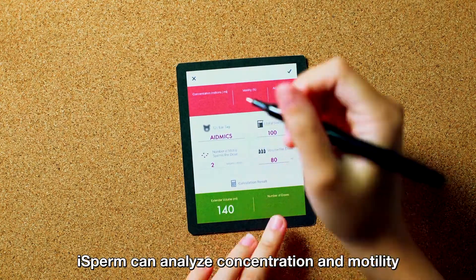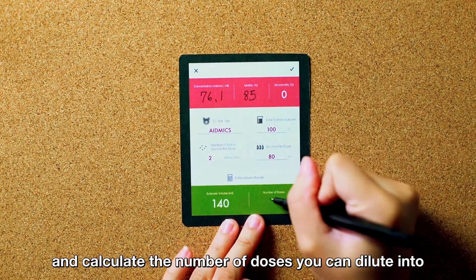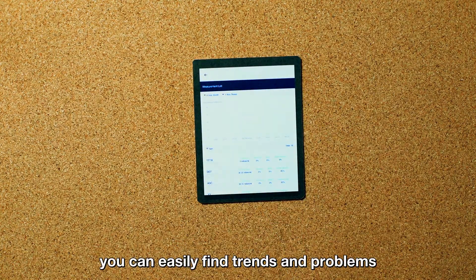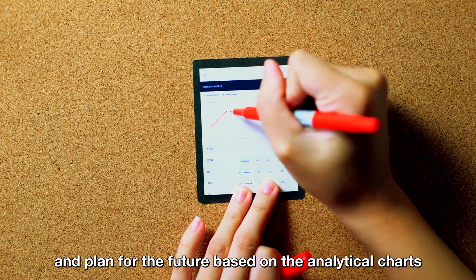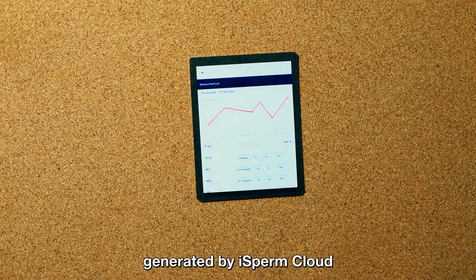iSperm can analyze concentration and motility, and calculate the number of doses you can dilute into. Also, you can easily find trends and problems, and plan for the future based on the analytical charts generated by iSperm Cloud.